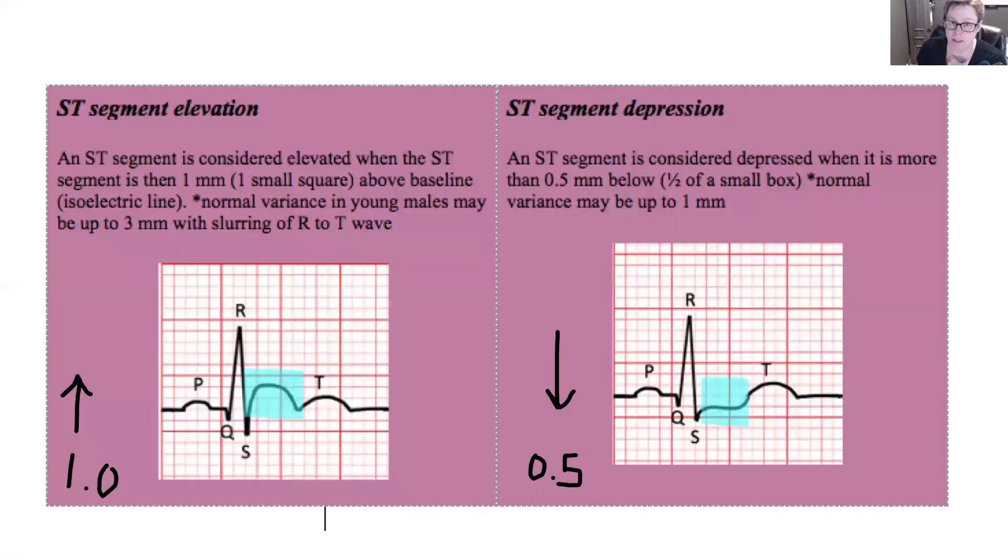When the ST segment is not on baseline, then we want to look to see if it's elevated, or if it's below the baseline. So here we have an example where it's elevated. So I have my isoelectric line, and all of a sudden, whoa, where did that ST line go? That's pretty high up there. This would be called ST elevation, because it's above baseline. An ST segment is considered elevated when it is greater than one millimeter, and one millimeter is the same as one small square, above baseline. So it doesn't have to go very far in order to be considered an elevation. This may also be normal in young, healthy adults, so you just want to make sure it's matching the clinical picture.